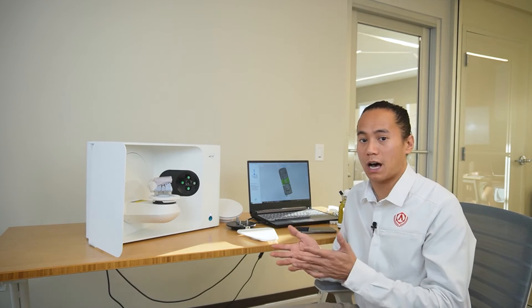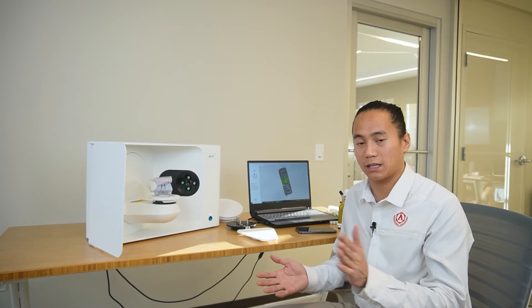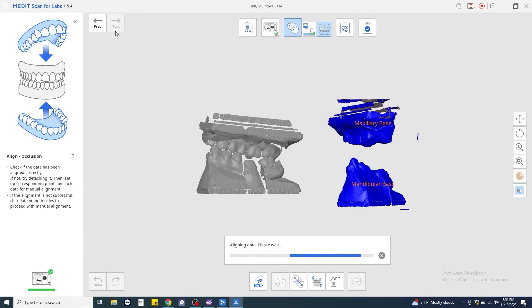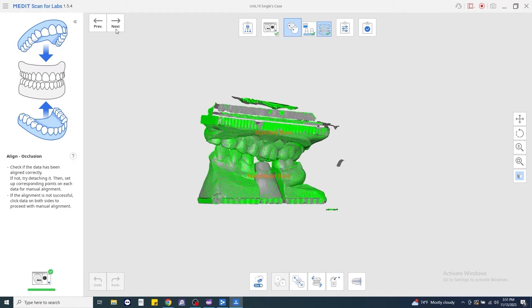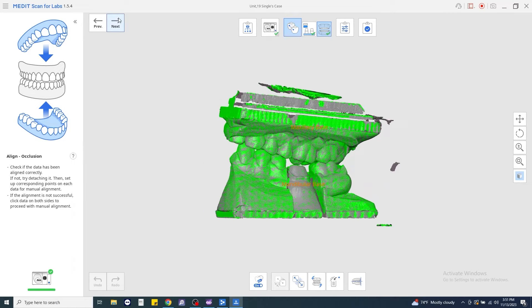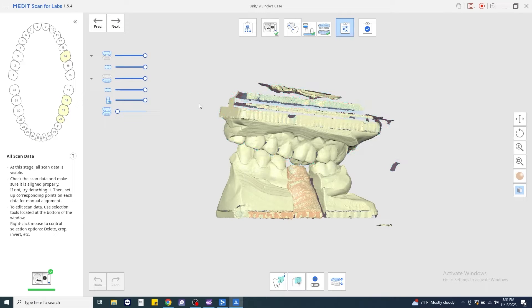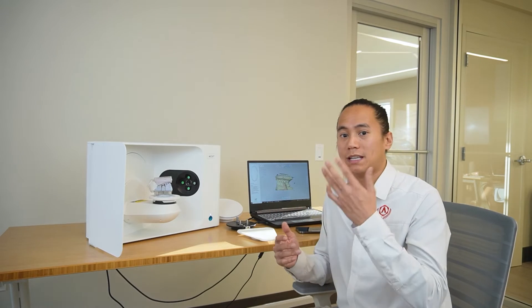The final step in the process is the software will align all of the individual scans together. So you just confirm after each alignment. And what we're going to look for is a nice gradient between your scans. And from there, now that all of your scans have been generated, we're just going to crop them. And then you can send those STL files or PLY files off to the lab to get designed, or send them right into ExoCAD to design them yourselves.